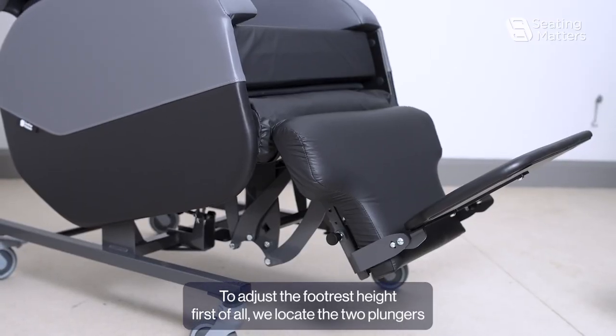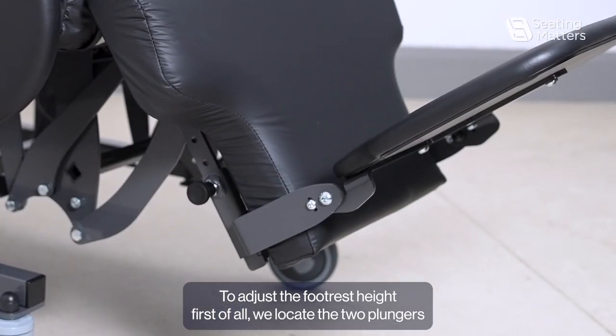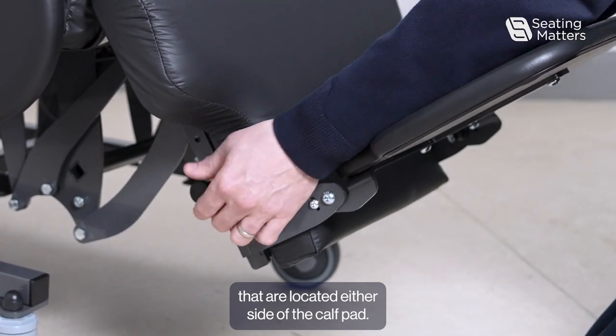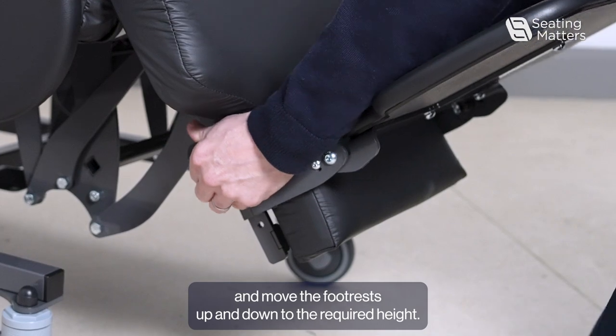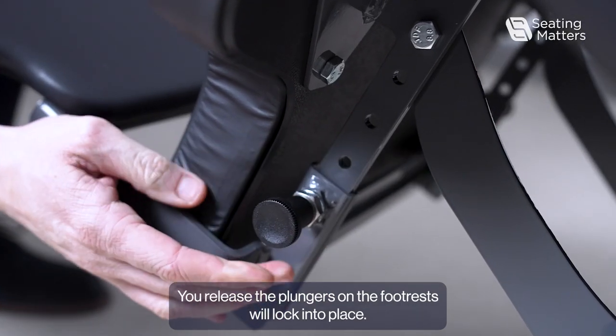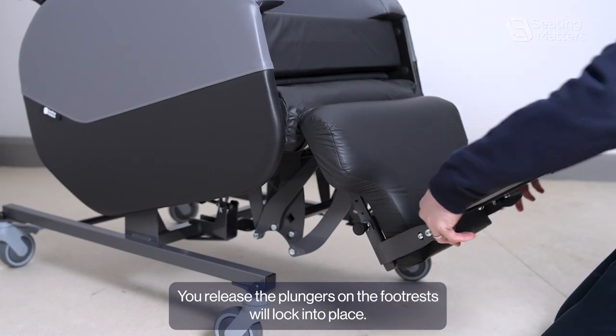To adjust the footrest height, first locate the two plungers on either side of the calf pad. Pull the plungers out and move the footrest up and down to the required height. Release the plungers and the footrest will lock into place.